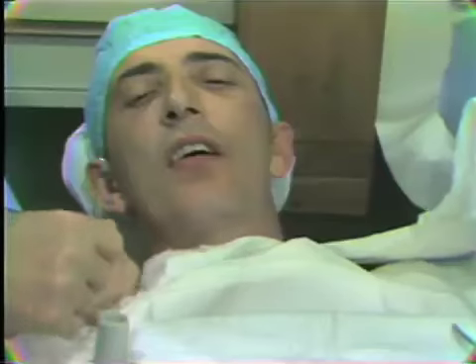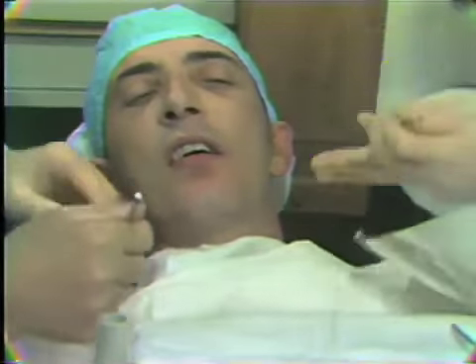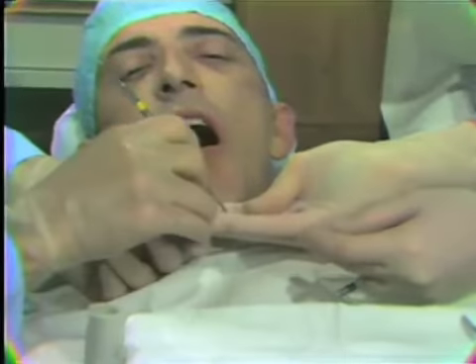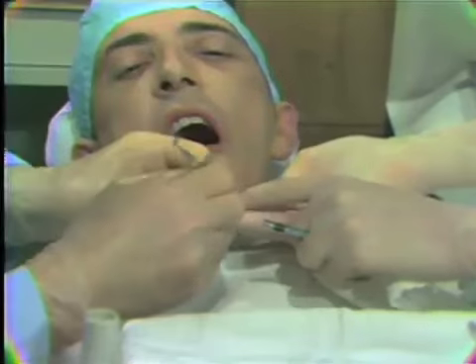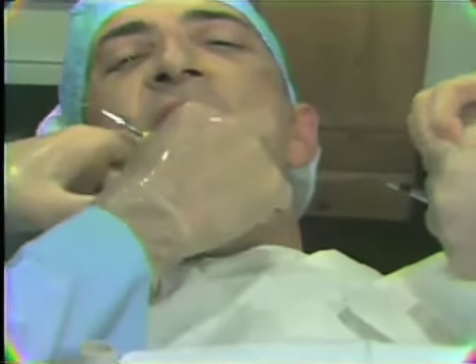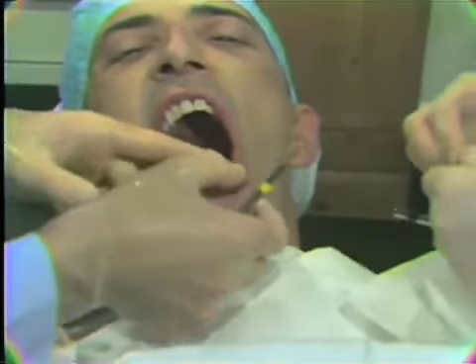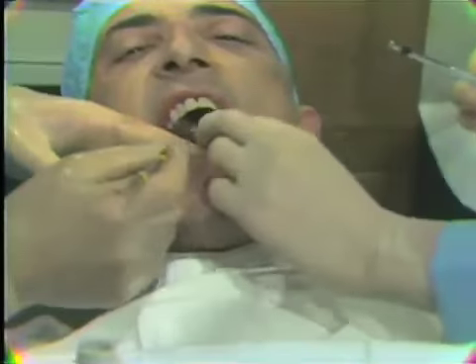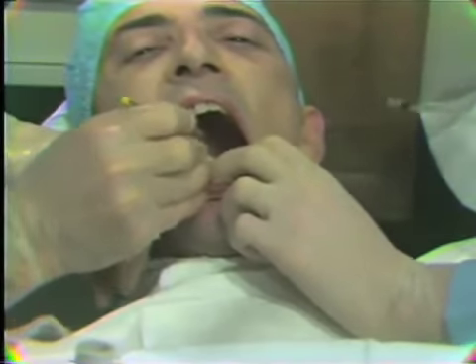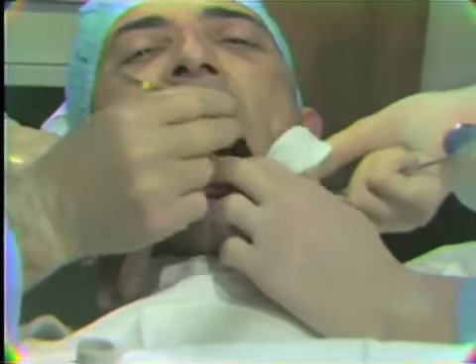The assistant has visualized the approximate amount of dressing that we will need and the diameter of the roll we will need, and we will simply then take a portion of that size roll of dressing, carrying it to the mouth, adapting it first on the lingual. Retract the lip, please. Adapting the dressing then into the interproximal area. Our assistant is standing by with a gauze to take the excess dressing.